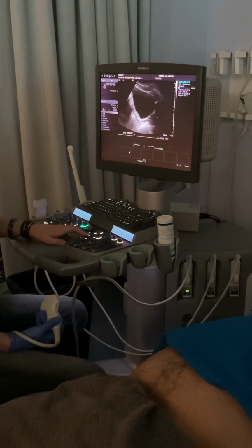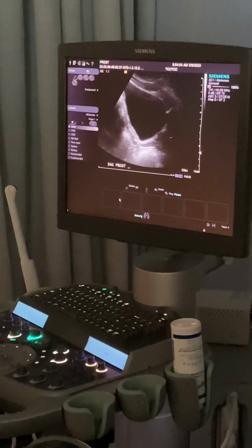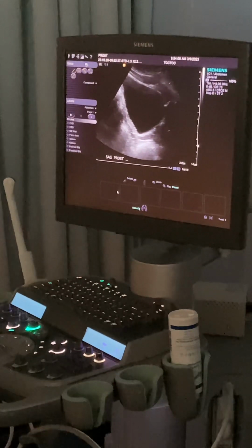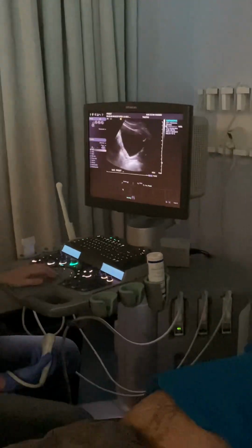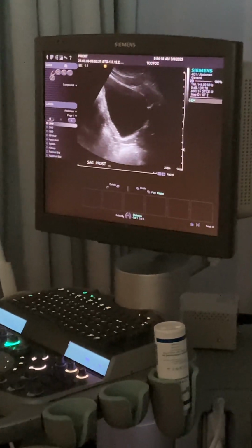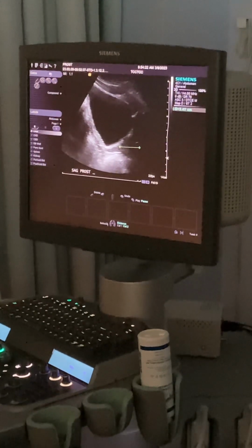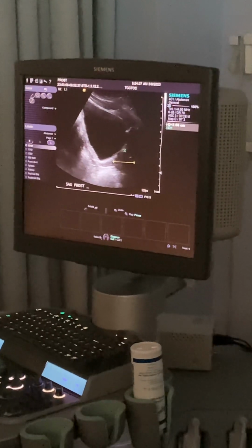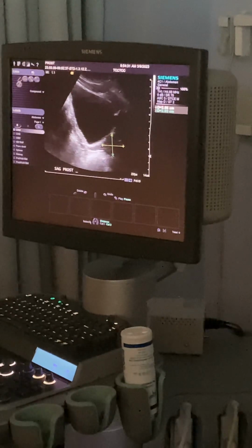So our first image is just going to be sagittal prostate, and again, you're going to see these going by on your renals. You aren't necessarily going to be imaging this specifically unless something catches your eye about it or it appears enlarged. It should be about 4 centimeters or less in all dimensions. So next up, we're going to put a caliper. I'm going to imagine this as a circular structure. Here I have a little bit of seminal vesicles. We're just going to ignore that. We're going to do a superior to inferior. Next, we're going to do an anterior to posterior. So there's our first set of measurements.